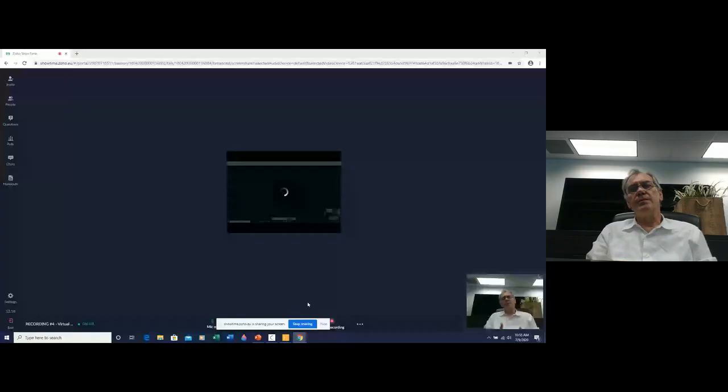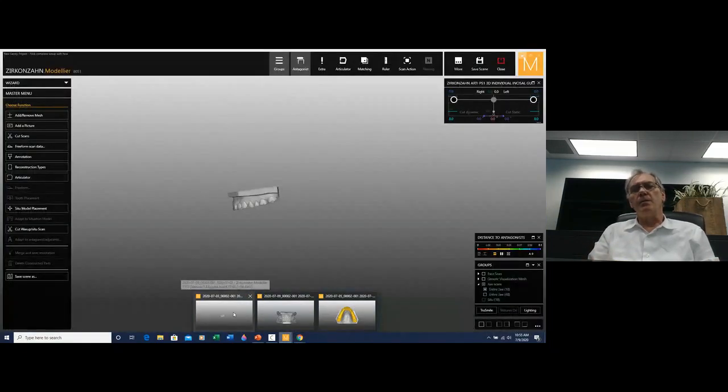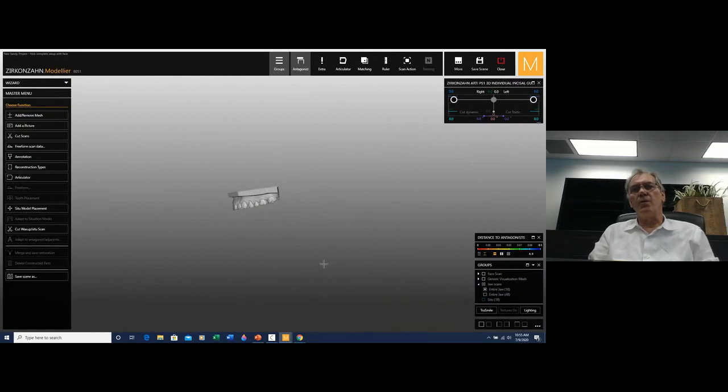And here we are. We're back on board, and I'm really pleased that we made this little video to show you how easy it is to set these bows. It doesn't take more than 5 minutes, and to perform the recordings, it's another 5 minutes. So the operation lasts more or less around 10 minutes, and with just 10 minutes of our time, we can get perfect data to set up our articulators and make sure that whatever we're going to go through is as accurate as possible.